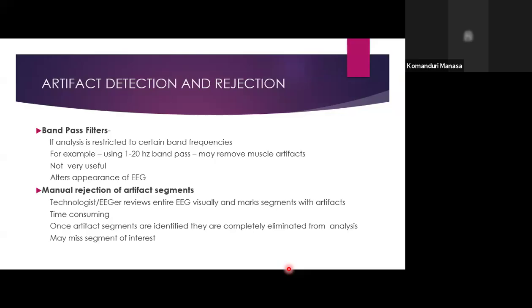Grounding of the system, various noise. If you have a lot of interference from the external environment, that can be a problem. Both your machine as well as the plug point should be adequately grounded. Earthing should be good, the electrical connection.